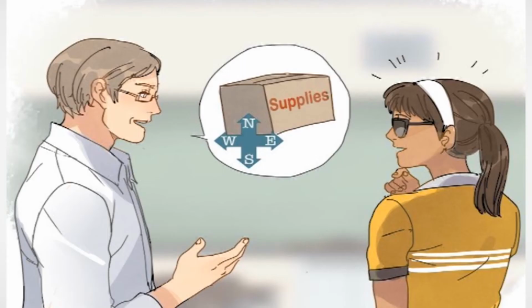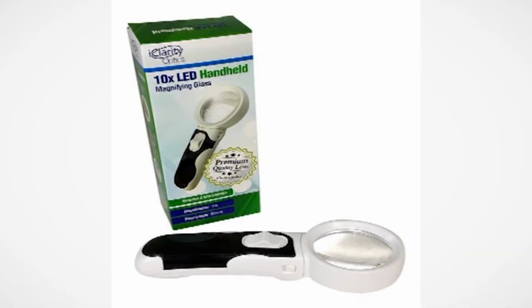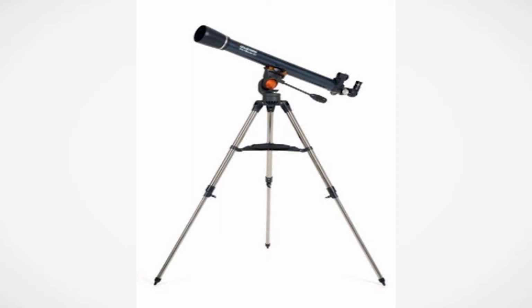These devices are used by blind and visually impaired persons who have severe low vision conditions. Optical devices such as magnifying glass involve the use of lenses to improve vision. Categories of low vision devices. The two most common low vision devices are magnifiers for seeing objects close at hand, known as near viewing, and telescopes for seeing objects far away, known as distance viewing.